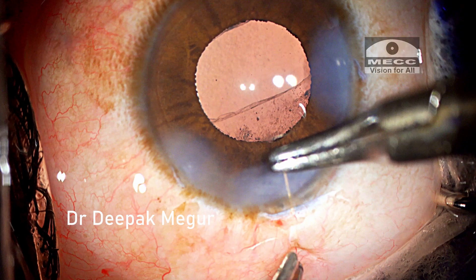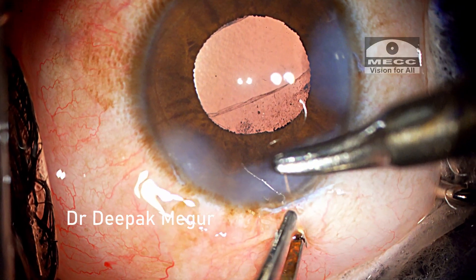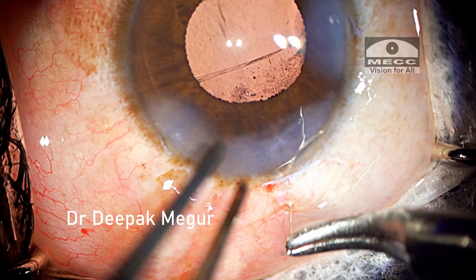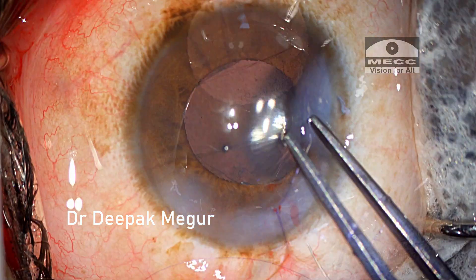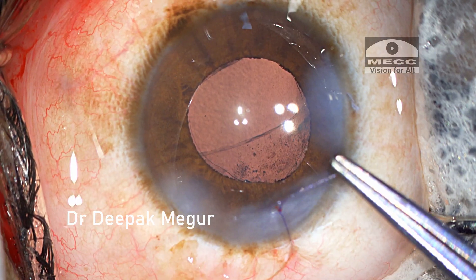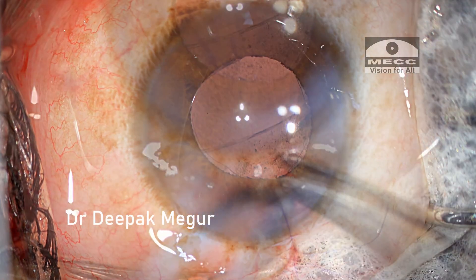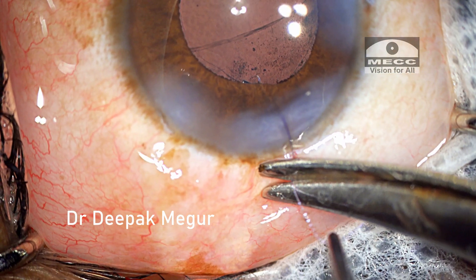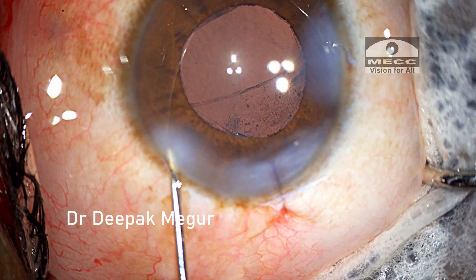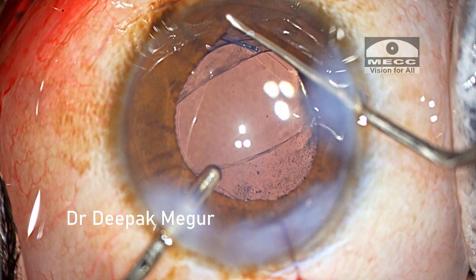I prefer to switch to the main incision as it was extended a little bit — I'm using 10-0 Vicryl for that. The side ports are hydrated. That's it — the case is done.